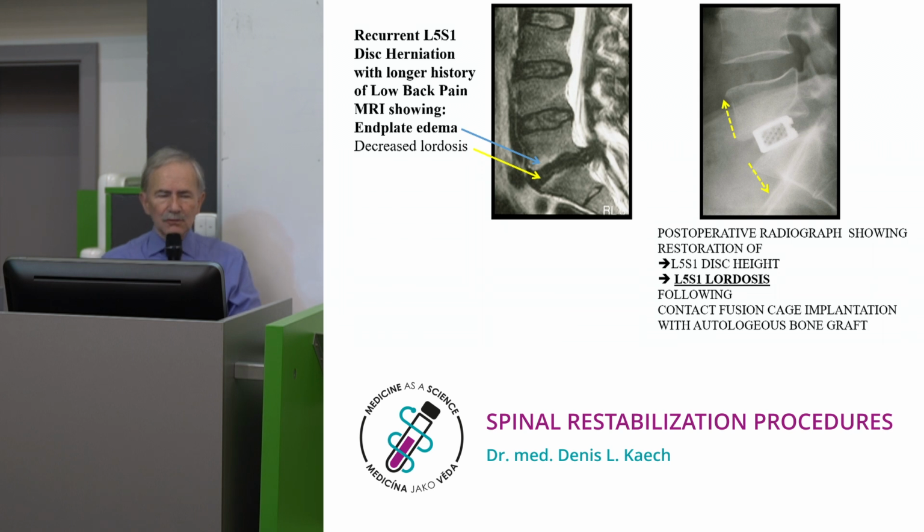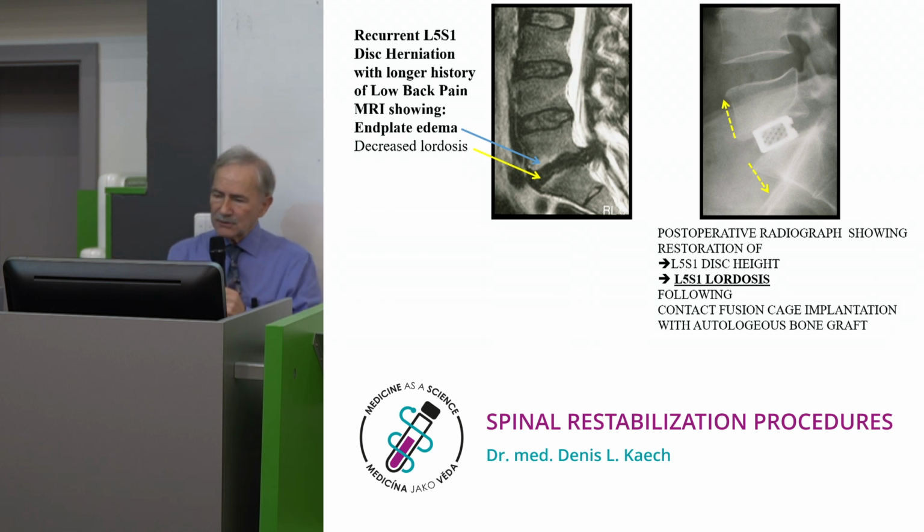We go to another case to tell you about the intervertebral fusion cages. Intervertebral fusion cages: when you empty the disc at a disc herniation operation, why leave this hole open? Put something inside to stabilize. This was the philosophy of the disc cages that came up in the 90s of last century. Check this level.